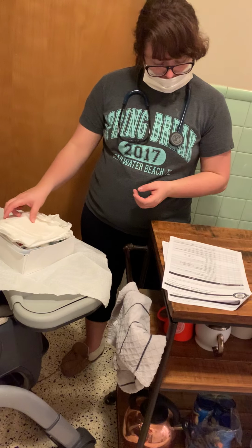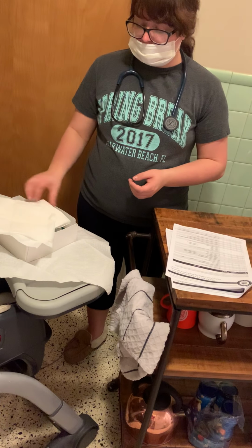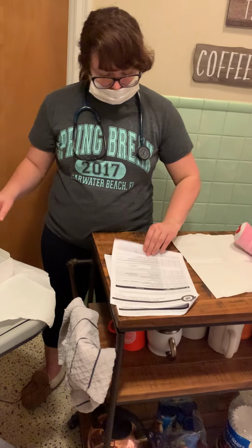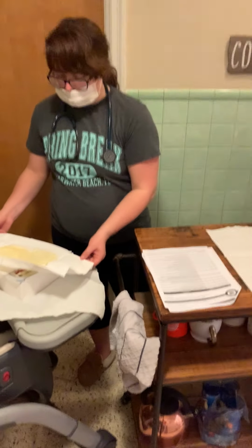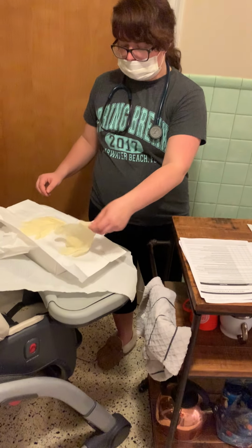I'm going to try to keep my right hand sterile at all times throughout this procedure. Right. This pad is going to go under my patient's bottom to prevent soaking of the bed. Alright, I'm gonna get my sterile gloves out here, put them on. I'm gonna open them away and side to side as I would have done the kit.